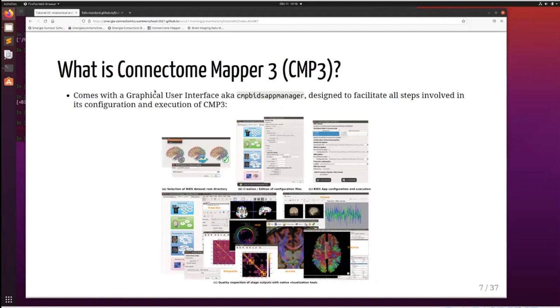Connectome Mapper is not only a Docker image run from the terminal; it also comes with a graphical user interface called the CMP BIDS App Manager. This GUI was designed to facilitate all steps involved in configuring and executing Connectome Mapper. You select your BIDS dataset, create and edit configuration files for each pipeline, configure how your BIDS app should be run and which participants to process, and then execute it.